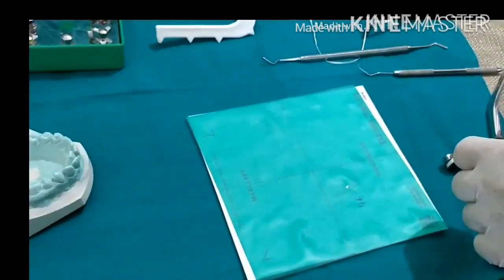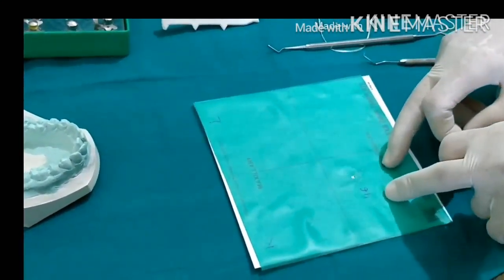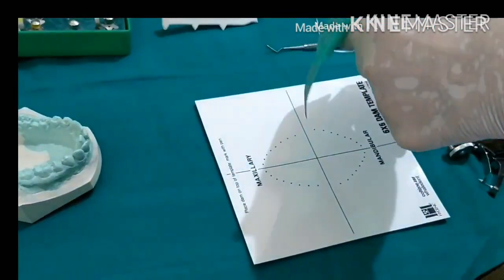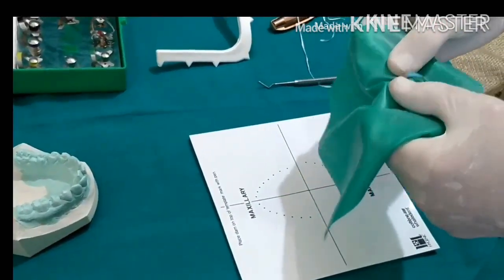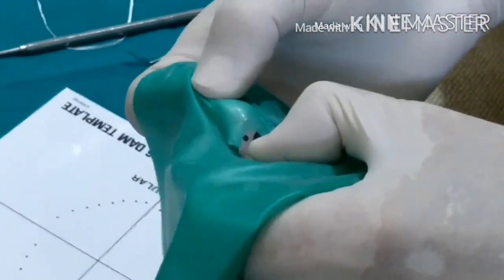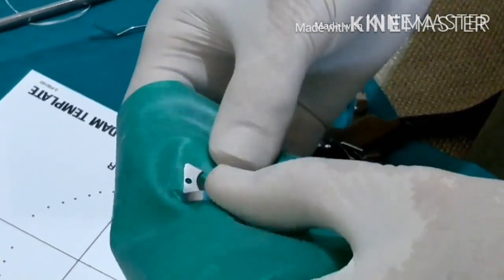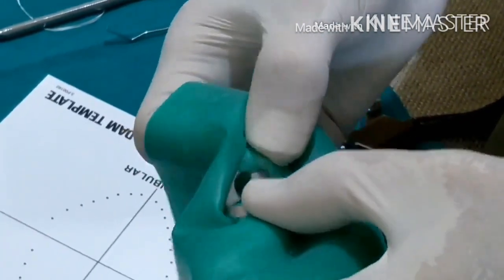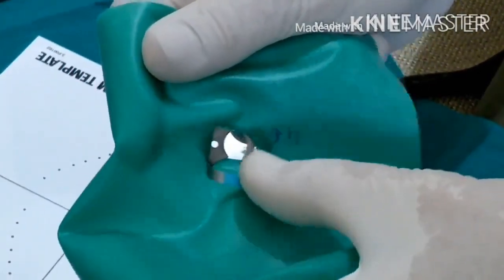There is another method of applying the rubber dam. After punching the hole — which is essential for both methods — in the second method you slip the rubber dam sheet around the horizontal bar of the clamp, then slowly wing it forward and slip it onto one wing and likewise onto the other wing. Now you should have the dam seated on both wings of the clamp.